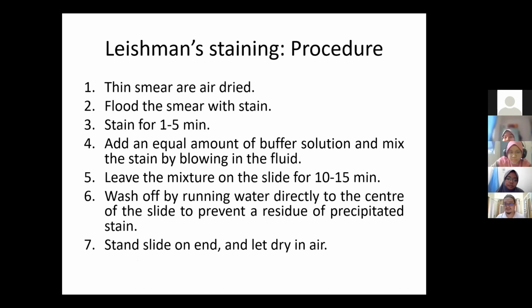Ada heater untuk nak cepat sangat ni, tak boleh. Okay, it has to be a gentle process. The mixing of the anticoagulated blood pun gentle, and when we air dry pun gentle, yeah. So we leave it on the bench and dia tak ambil masa lama pun. So dia dry on its own.